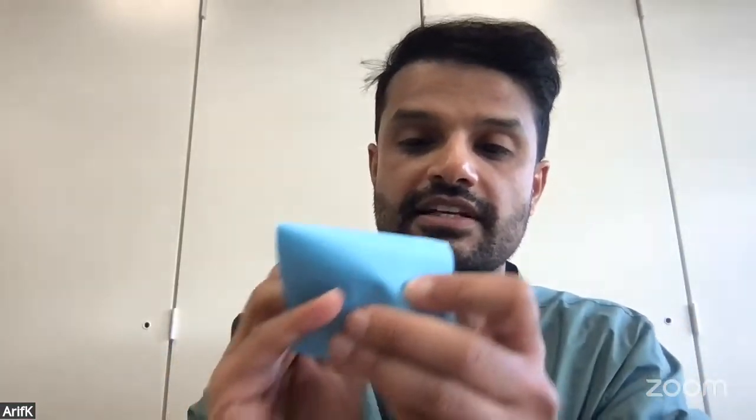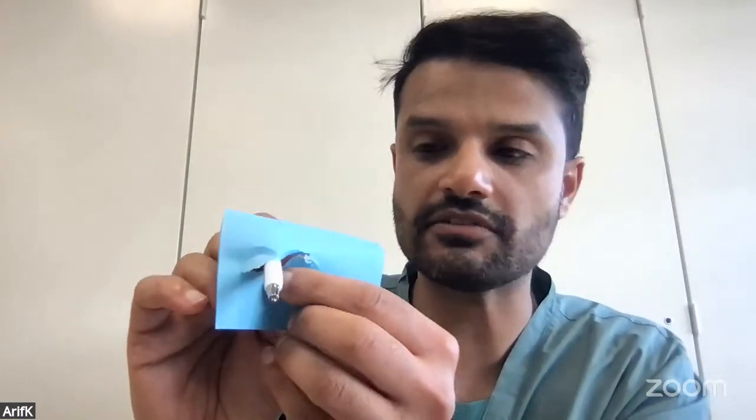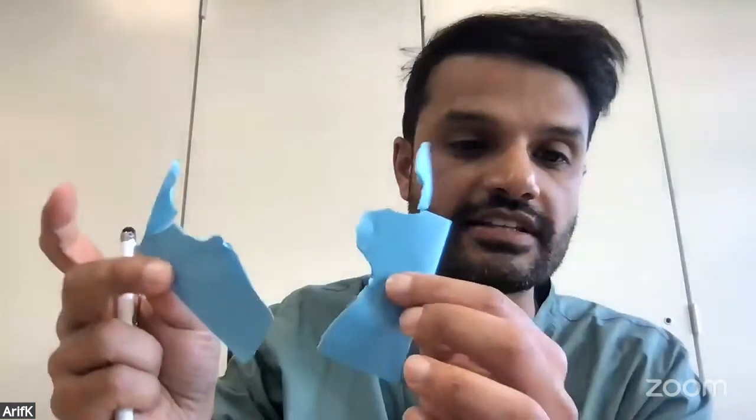Here's the leaflet of the unicorn. It's causing the obstruction. What you're essentially doing is poking a hole inside the leaflet like that, and then making that hole bigger, bigger, bigger. Eventually you come with your valve and essentially avulse the leaflet. It doesn't break off, but you avulse the leaflet completely. So that's the fundamental principle of how the two are different.